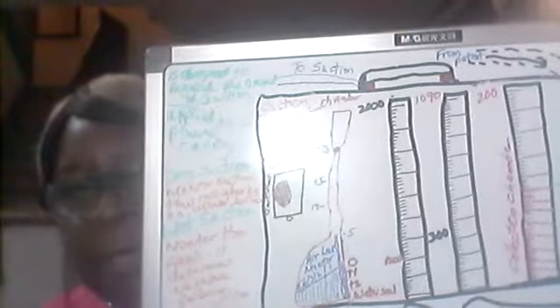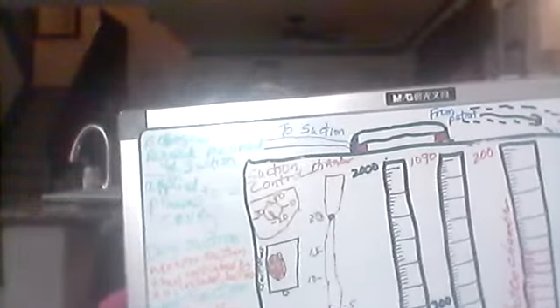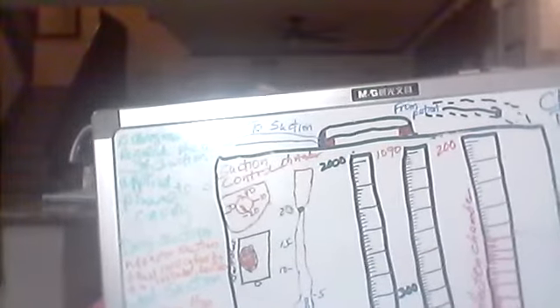You got to remember that it has to be set at minus 20, that's the suction control, minus 20 centimeters of water, okay? This is my drawing. I'm not sure if you could see. Minus 20 centimeters of water to maintain negative pressure in the system. Those things the boards will ask you.